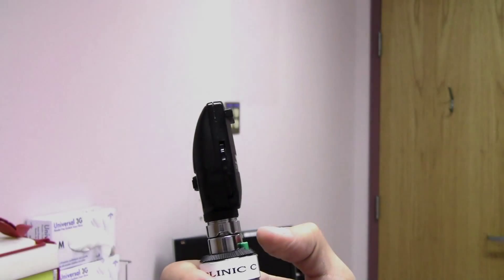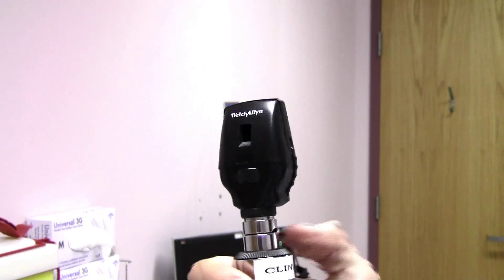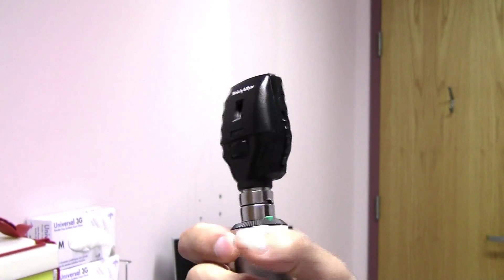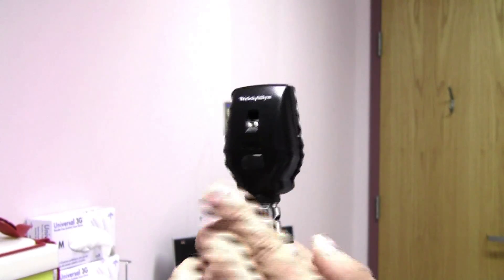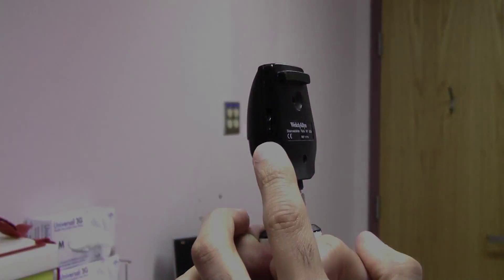Let's review the knobs of the direct ophthalmoscope in detail zoomed in. The knob to turn it on is right here. To switch the illumination, the knob is right here in the front. To change the refractive power and focus, the knob is on the side here.